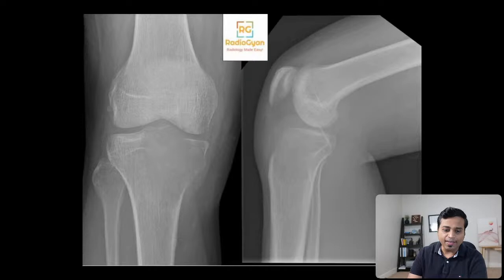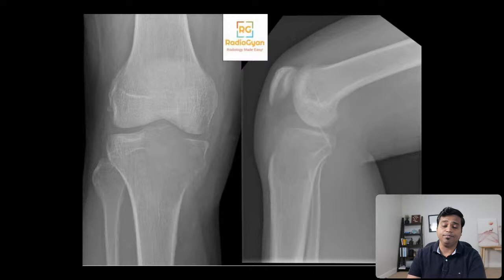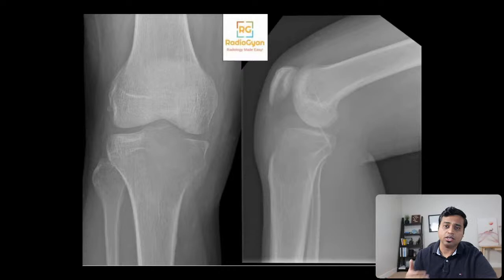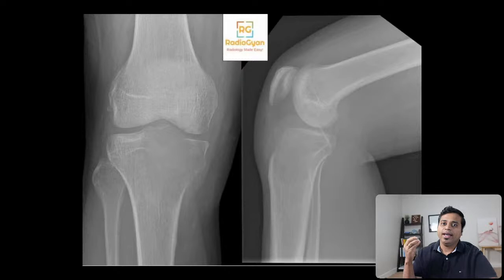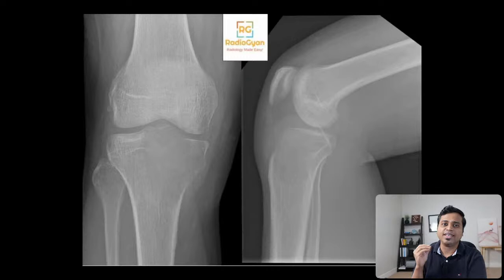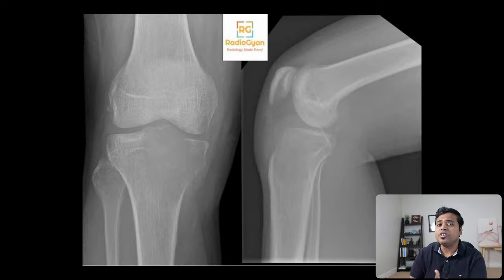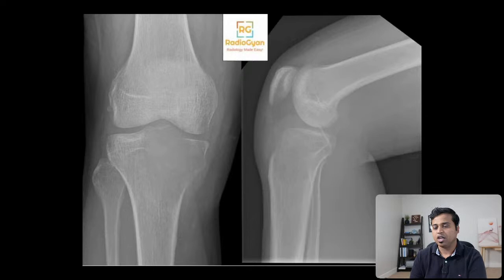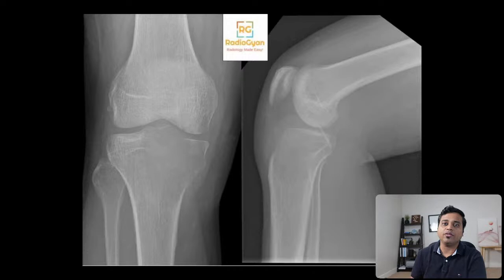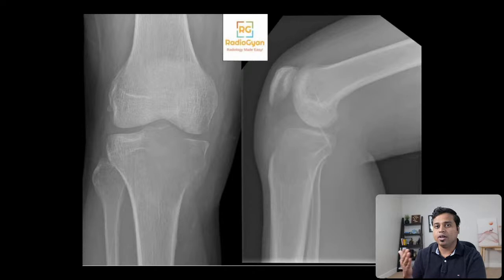There is this ill-defined lesion involving the proximal tibia, reaching up to the articular surface. There's no definite cortical breach, and there's no matrix calcification. The lesion involves the epiphysis in an adult patient. For epiphyseal lesions, there are very few — the two main bone tumor ones are chondroblastoma and giant cell tumor. Do not call chondroblastoma in a patient with fused skeleton. Chondroblastoma is commonly seen when the epiphysis is not fused, whereas in patients with fused epiphyses, the diagnosis should be giant cell tumor.